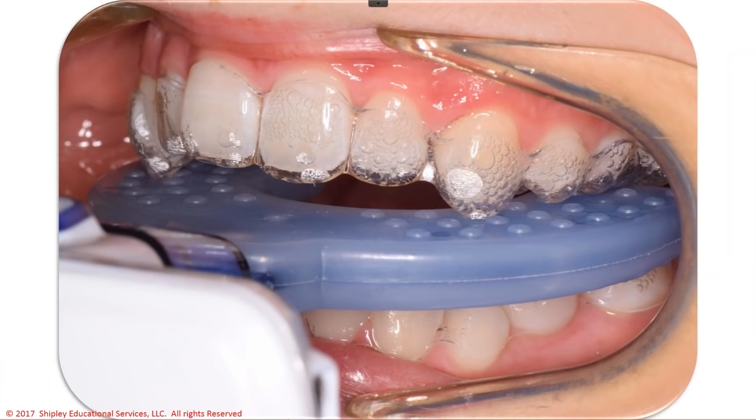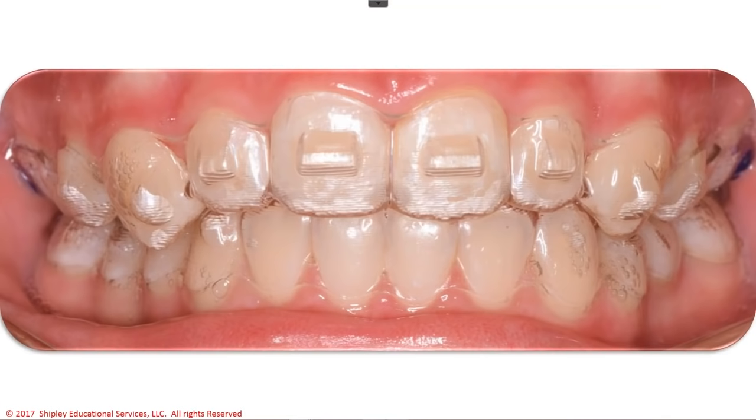Remember, I'm thinking in my head, I'm going to lose $400 to $800 on this anyway, so it'd be much easier for me just to grab the device off the shelf, give it to the patient. I only spent $250, $290 for it at bulk, and then the patient puts it in their mouth, and we fully seat the aligner that day. It's not hurting because of the pain reduction that I talked about previously with my study. And so that's what we did for the patient. And then without having to do a refinement, we were able to get the aligners seated very, very nicely.